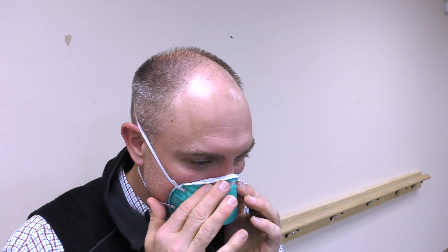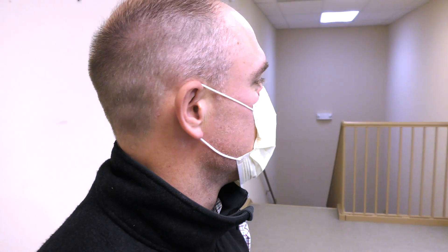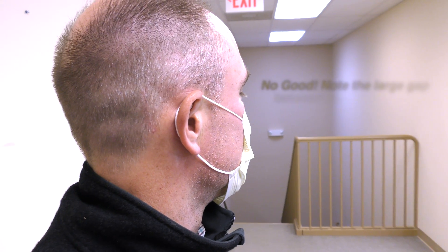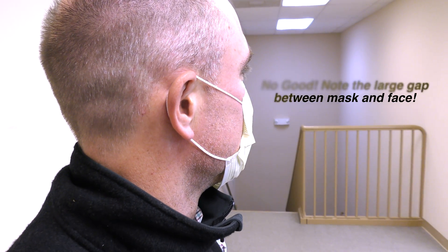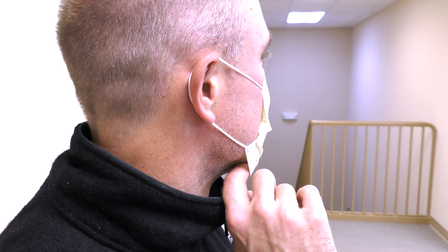The N95 mask is superior to a regular surgical mask because of its tight fit that filters out at least 95% of particles in the air, including small particle aerosols to large droplets. Surgical masks allow unfiltered air to enter from the sides, so regular surgical masks only protect from large droplets and do a better job of protecting others rather than yourself.